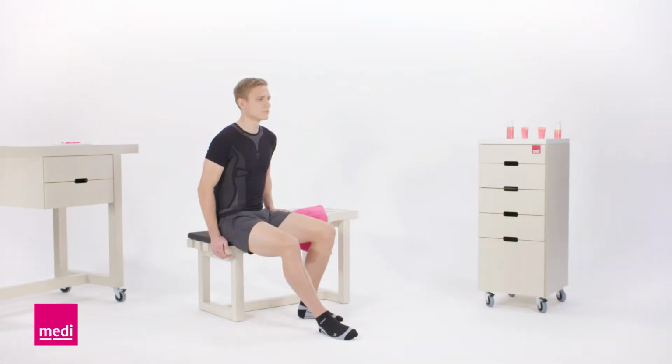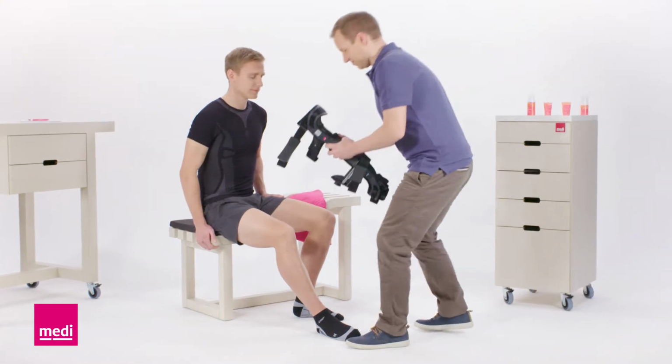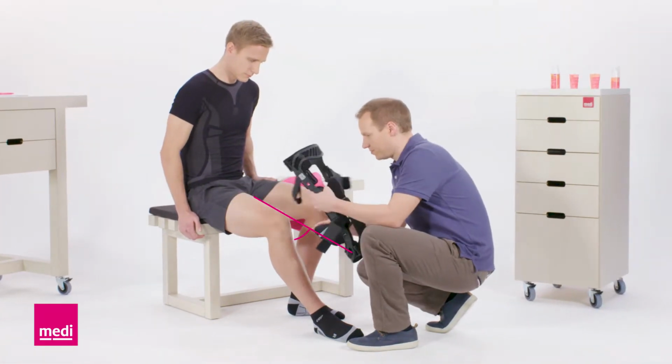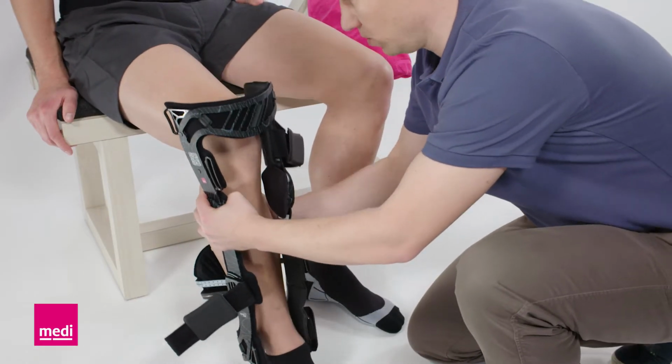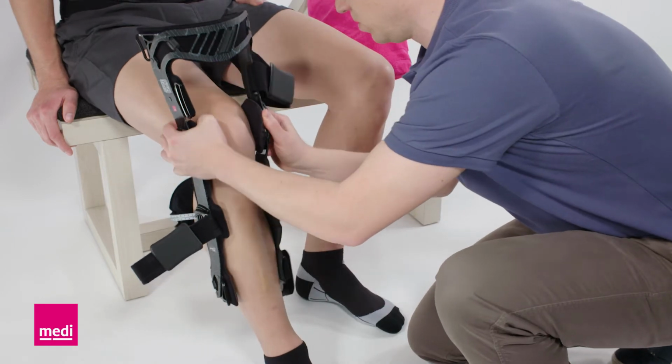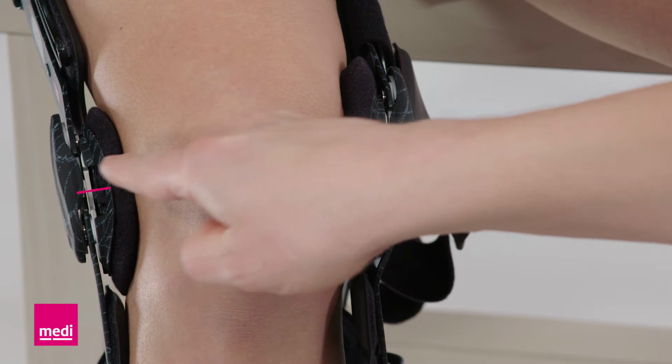It is best if the patient is sitting on the edge of a chair or a stool when applying the orthosis. The leg should be bent approximately 70 degrees. Now hold the injured leg at the calf and stretch the orthosis out over the knee. Position the orthosis such that the center of the hinge is located at the height of the upper edge of the kneecap.